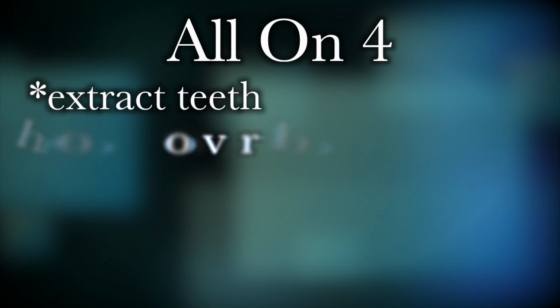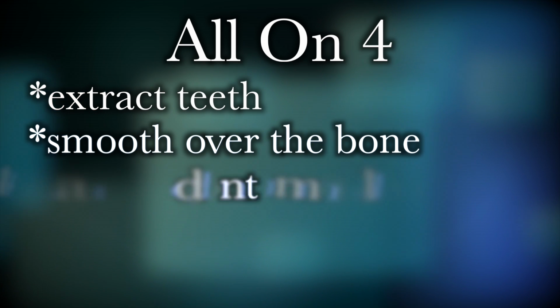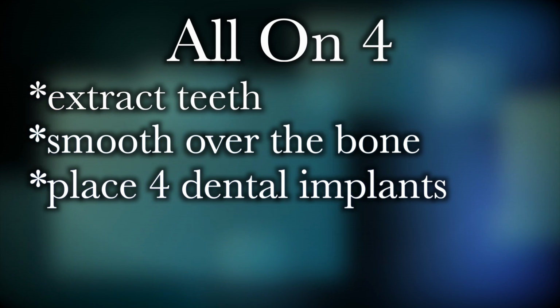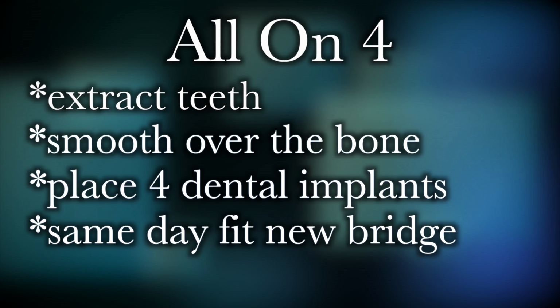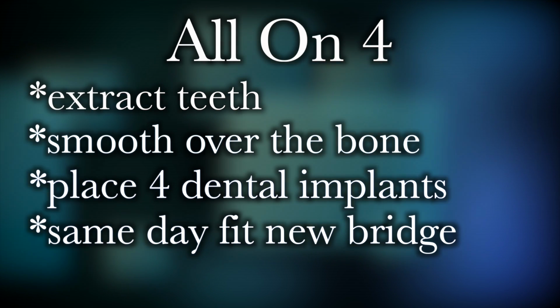Lynn's been struggling with a partial lower denture for many years now, as most people do with lower partial dentures, and didn't really like the idea of having a full denture. What we're doing for Lynn is we're taking out the remaining teeth, smoothing over the bone, placing 4 dental implants, and later on this afternoon Lynn will be given a fixed, full lower bridge. And this will improve the way her lower teeth look and allow Lynn to eat such things that she hasn't been able to eat for a number of years now.